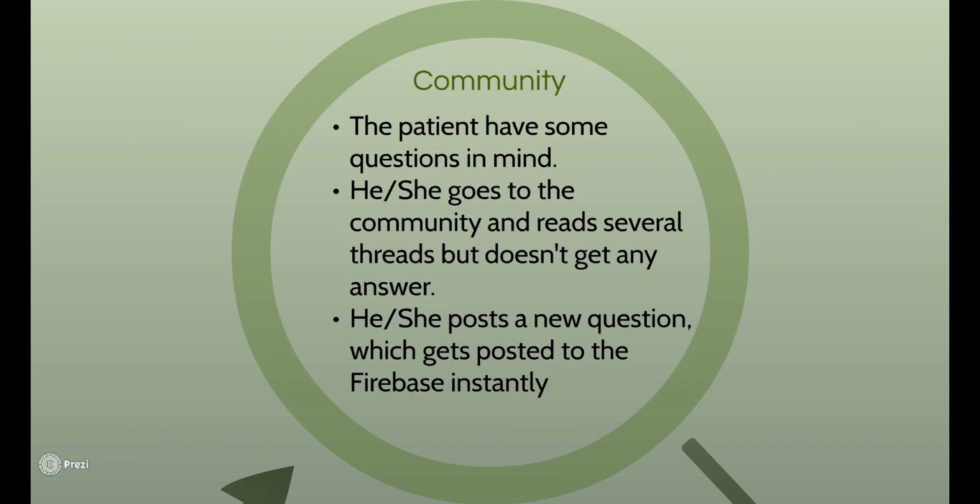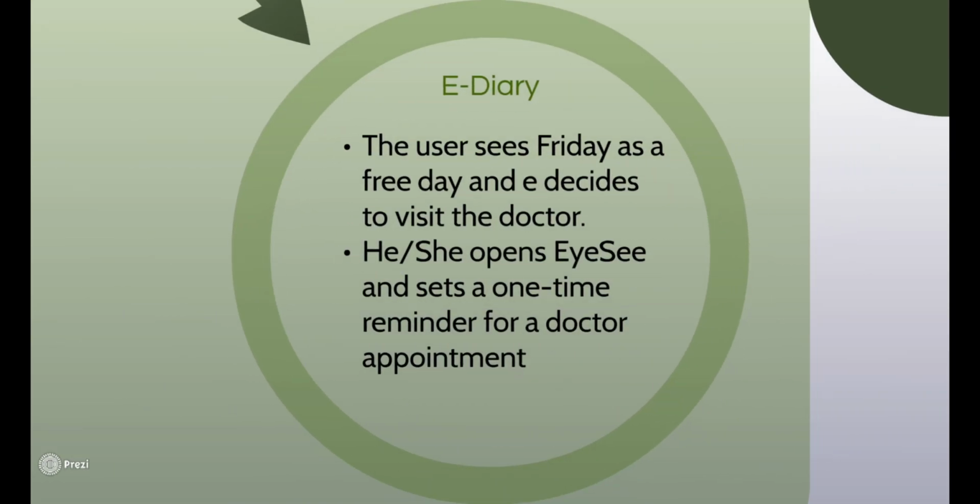If the user chooses to interact with the other users on the application, he or she can proceed towards the Community tab. Finally, if the user wishes to set some reminders for doctor's appointments or medications, then they can do so in the e-diary section.